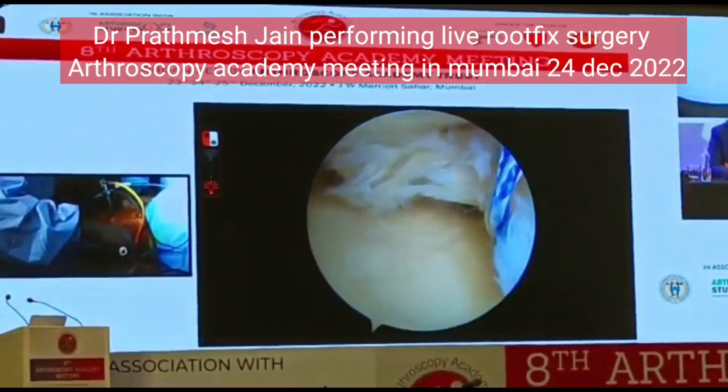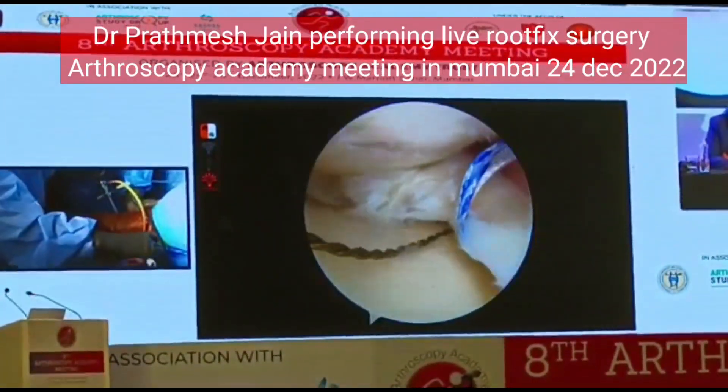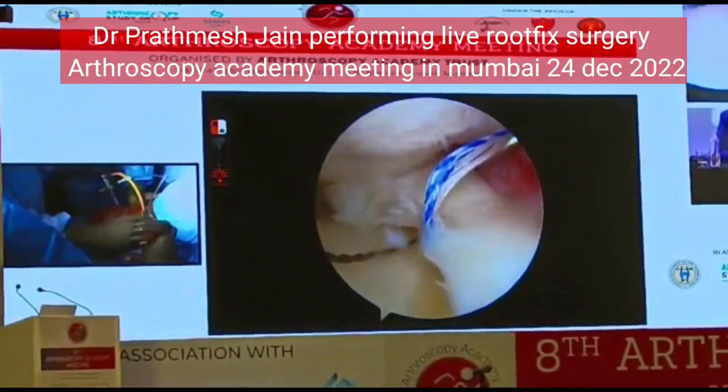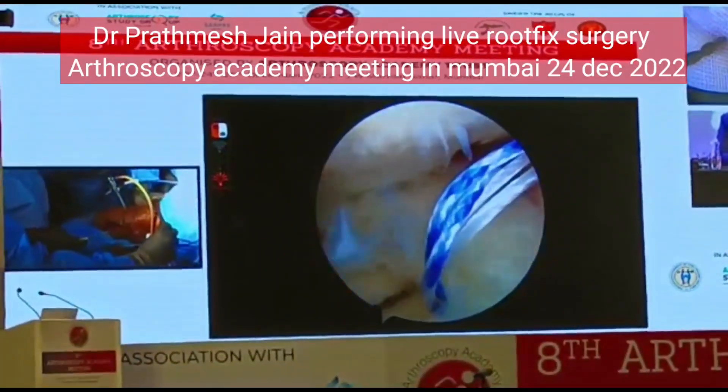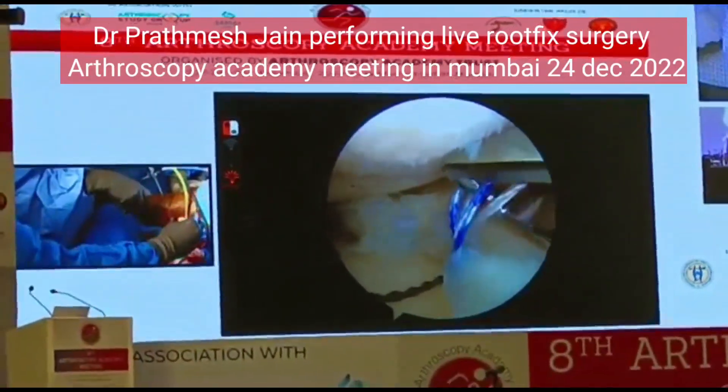Will your root anchor get purchase on the tissue on the meniscus at all? Yes, I will show you. So this is not a root anchor — this is an anti-extrusion repair anchor. We will be doing the second anchor for the root to correct the radial tear.